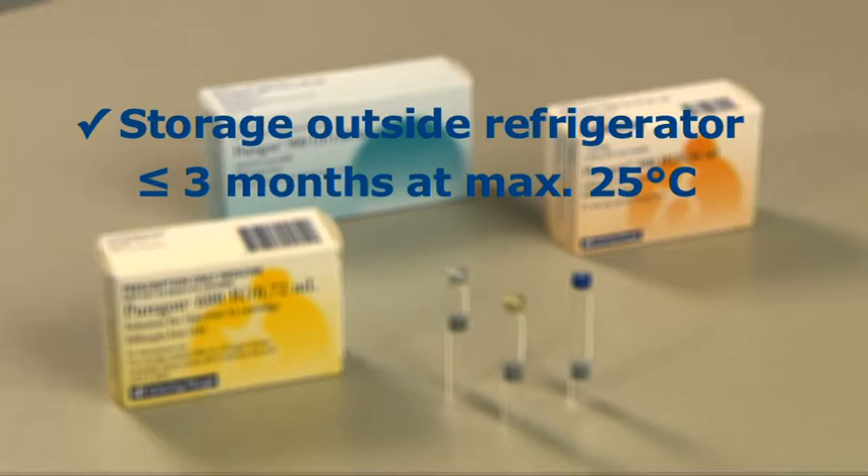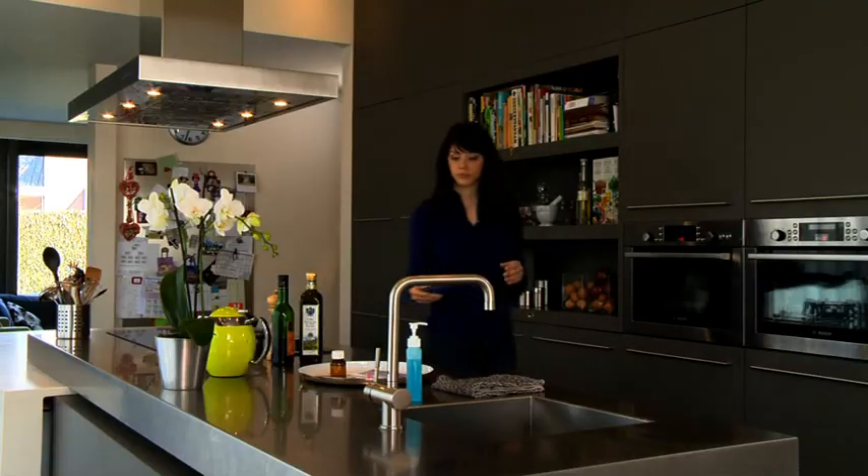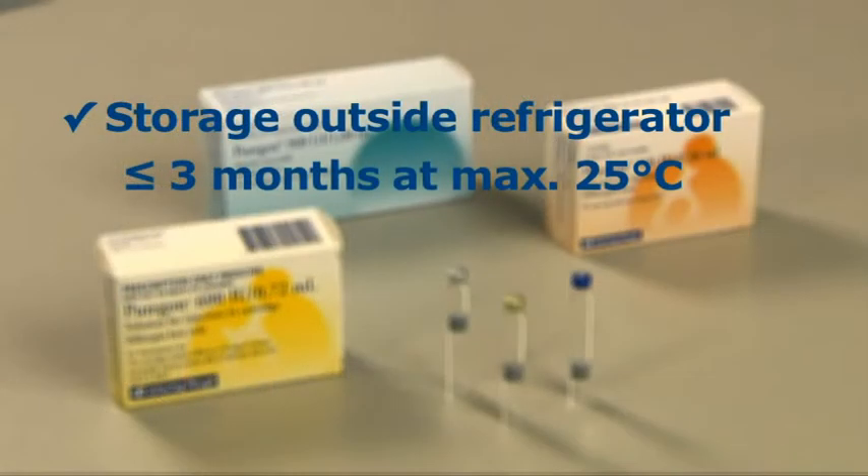Puragon should preferably be injected at room temperature, so remember to take the cartridge out of the refrigerator a few minutes before you are ready to give yourself an injection.